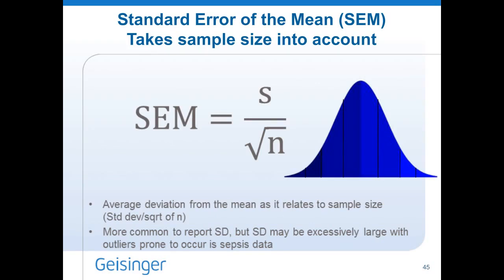But because of the way the laboratory has to do research, we kind of have to take what we get. If we had been given the capital for BACTEC any sooner than we did, we can't control when we get that money, and we can't delay it based on wanting to compare values. So you kind of have to take what you get, and your pre- and post-intervention periods don't always have the same number of data points. So the sample size is different, and this is where the standard error of the mean can help.